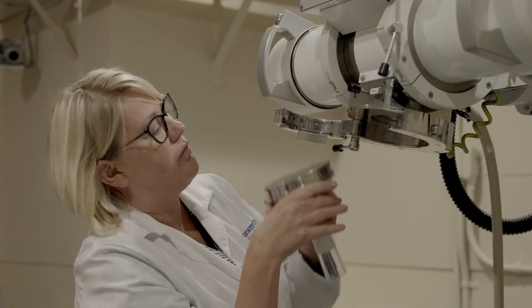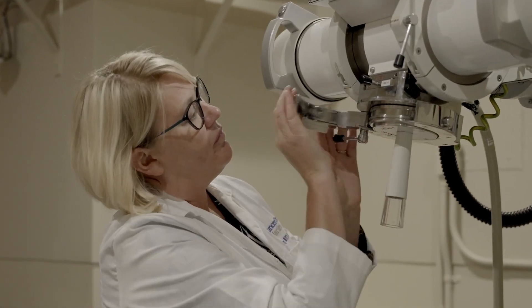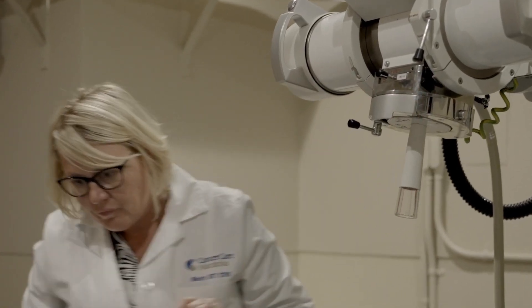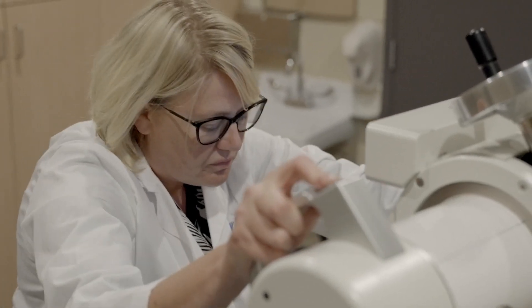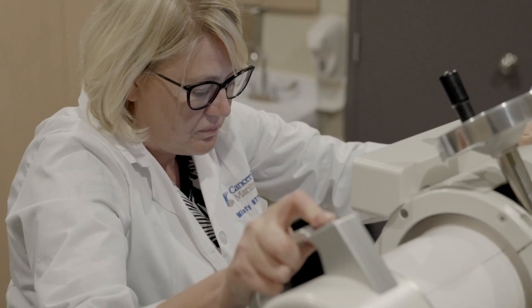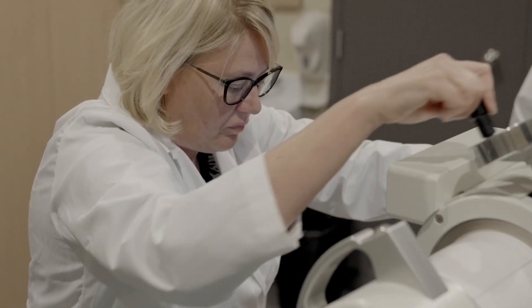Most of the time in the treatment room is spent explaining the procedure and placing you in your treatment position. The time the machine is actually on delivering treatment is the shortest part of your appointment.